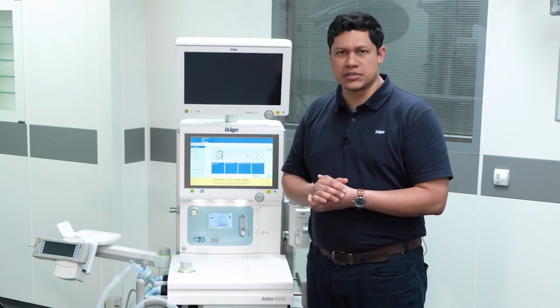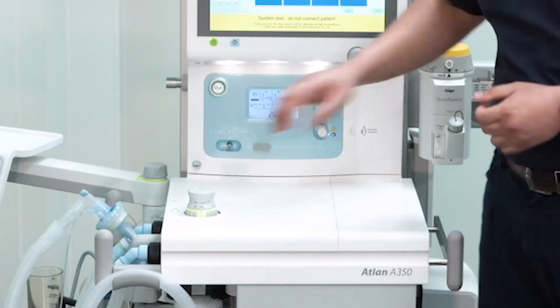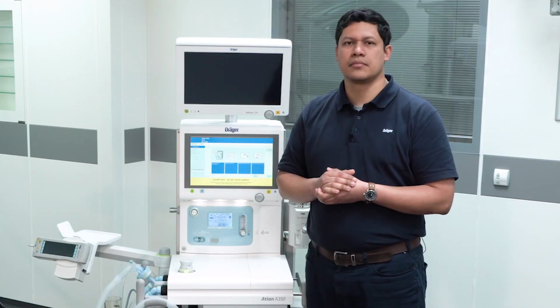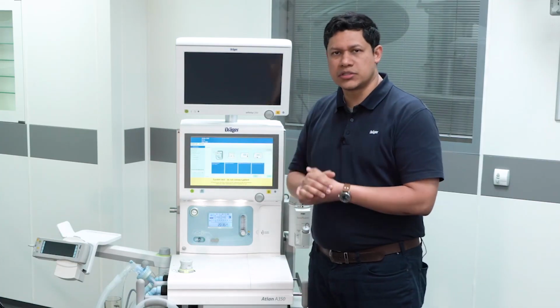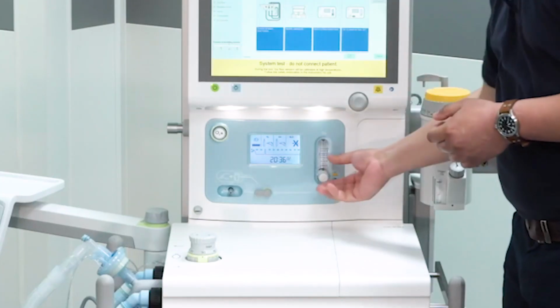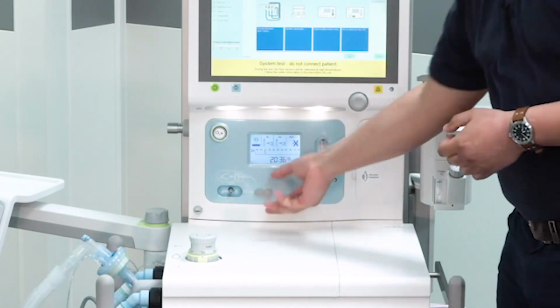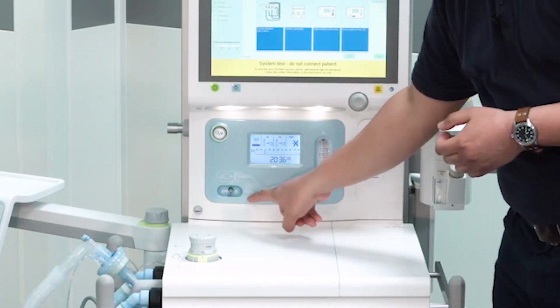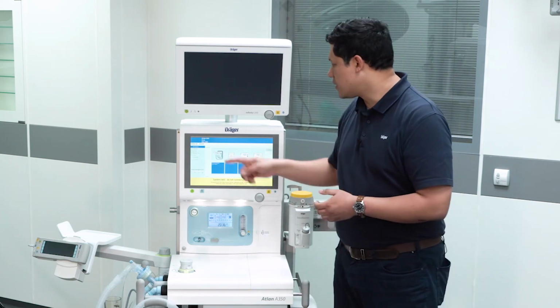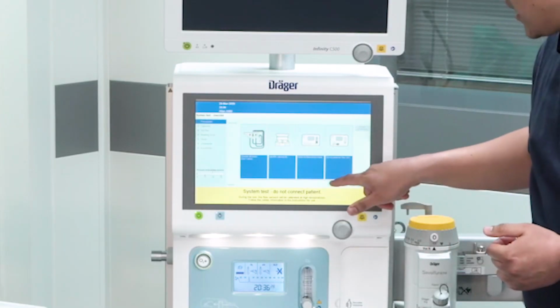The second prerequisite is to set the APL valve to a value of 30. The last two steps are to verify that the oxygen flow control valve is closed and to verify that the switch is set to auxiliary oxygen. Once you have verified the first four prerequisites, you press the check sign.